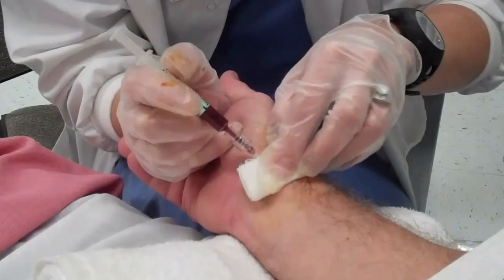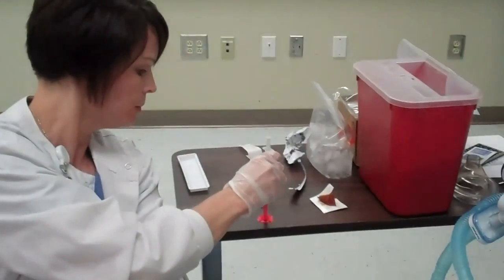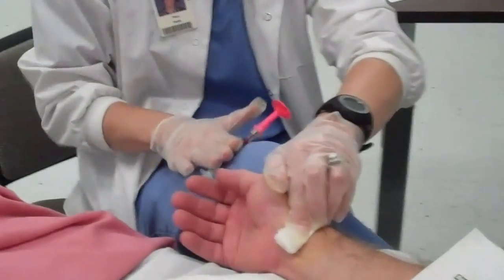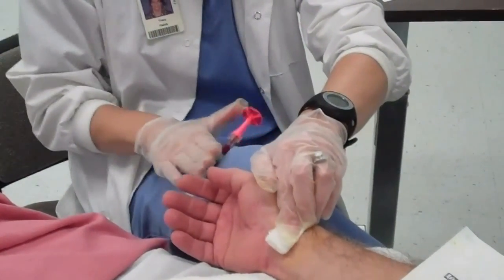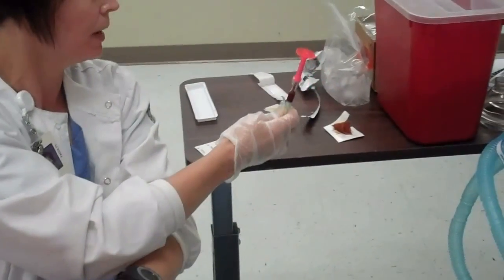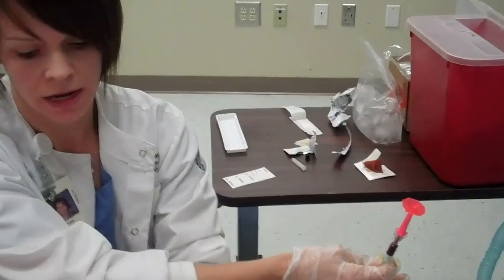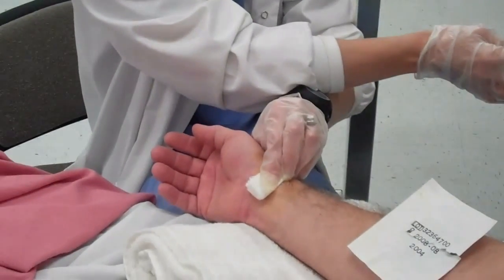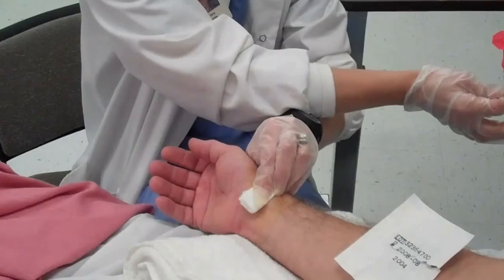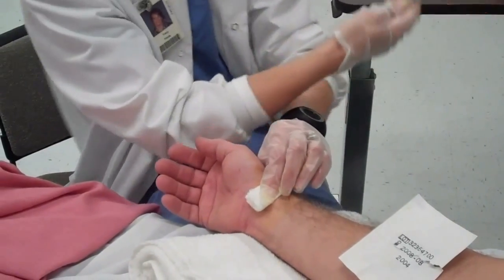I'm completely full. I'm going to grab, pull out, take my sample — hear a click. I'm going to take it and roll it, so I'm mixing the heparin. Then you can pop out any bubbles. I'm going to hold pressure.